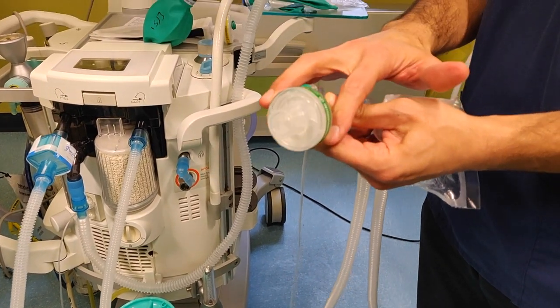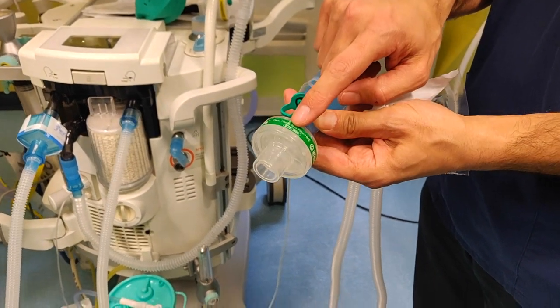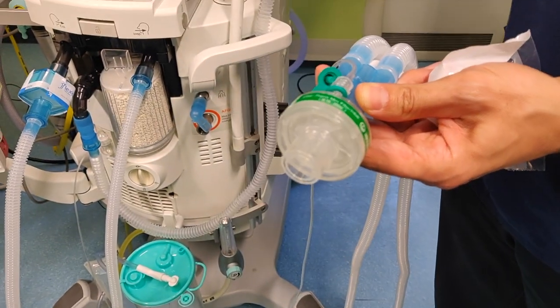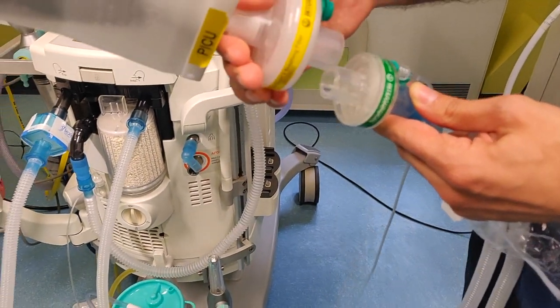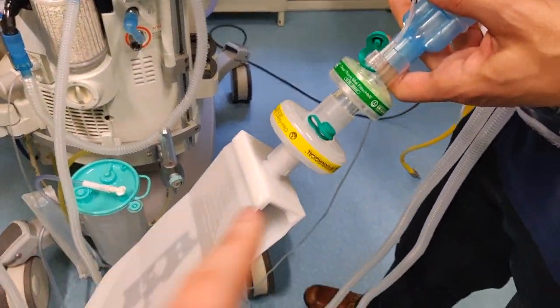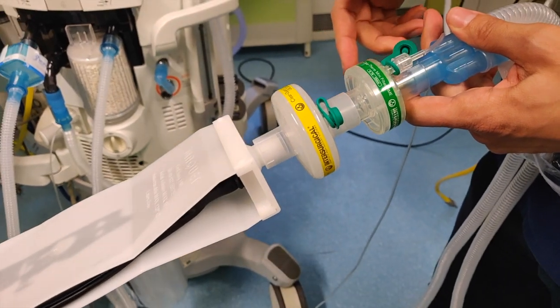There are different sizes of HMEs. This one's got tidal volume from 70 to 250 mils, so bigger for bigger patients and smaller for smaller patients. I'm just going to put the test lung down on the end of there. Coming to the screen — you wouldn't have the second filter; that's just to protect the test lung.